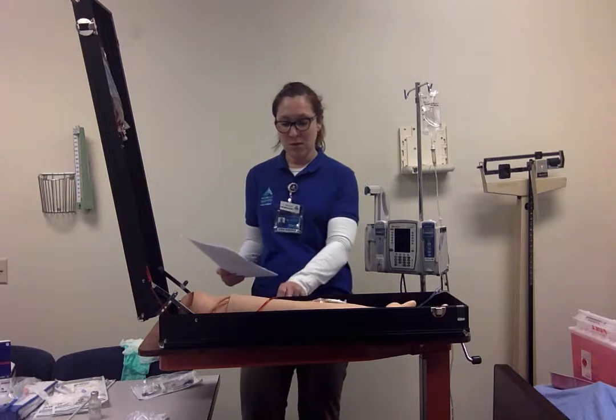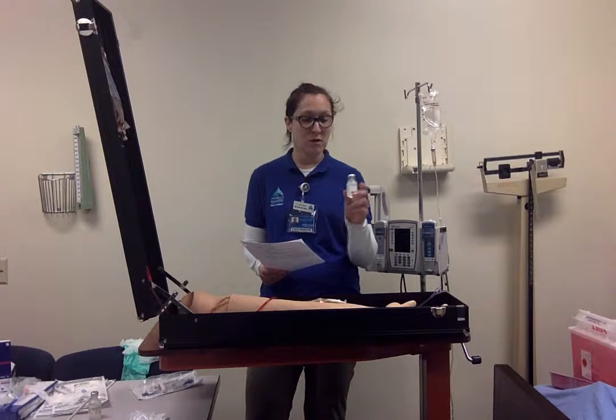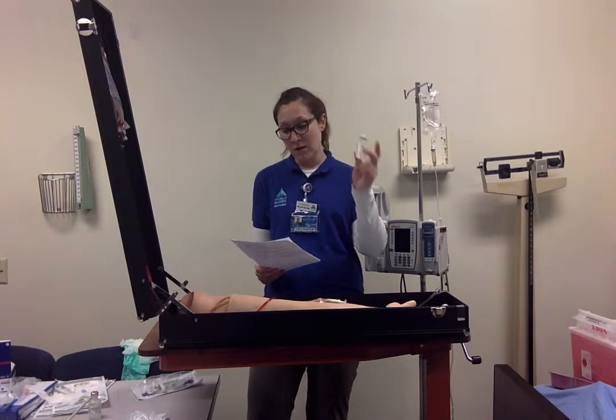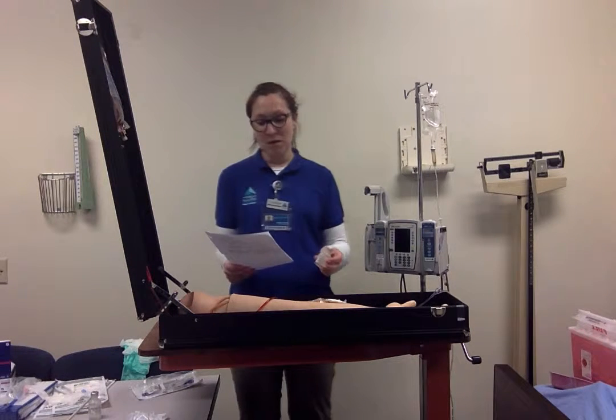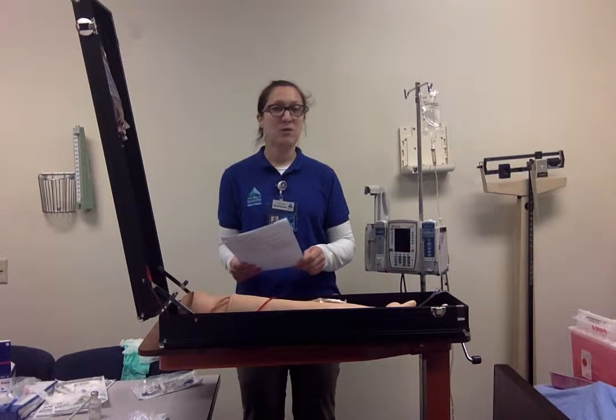What we have available is 500 milligrams per milliliter. I'm going to check to make sure it is not expired, make sure that it is indeed 500 milligrams per milliliter. We calculate it to be 2 milliliters for this patient at a rate of 17 drops per minute.